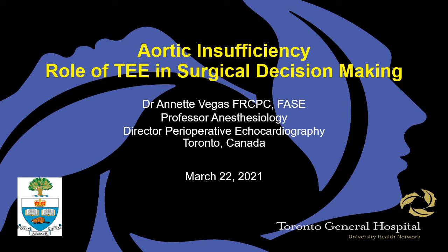I'm a staff anesthesiologist at Toronto General Hospital, Toronto, Canada. This session is on aortic insufficiency and the role of TEE in surgical decision-making.